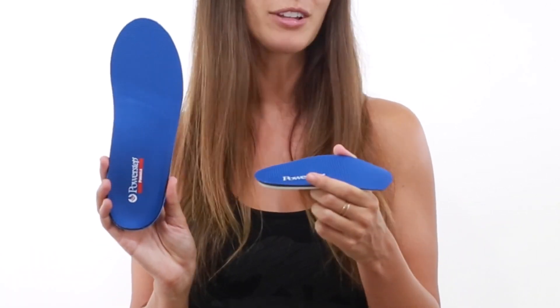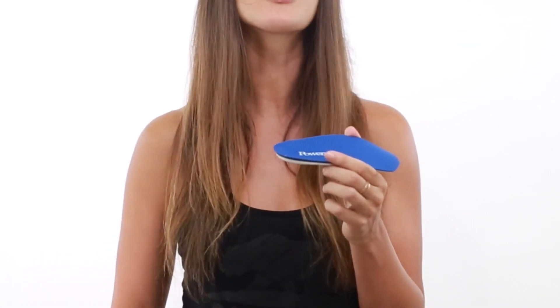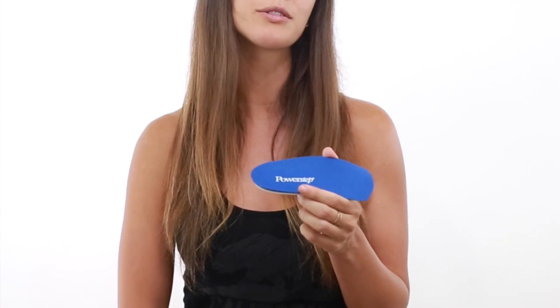Modeled after the PowerStep original full length, the Slim Tech offers a neutrally posted heel to help relieve mild overpronation and other common foot conditions such as plantar fasciitis.